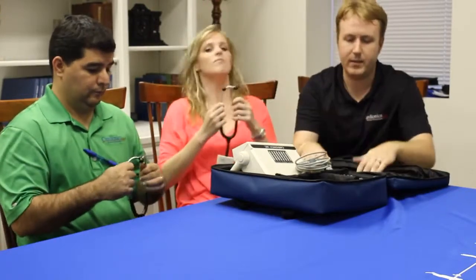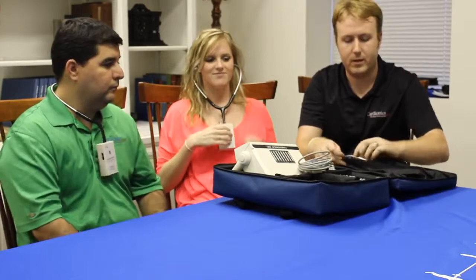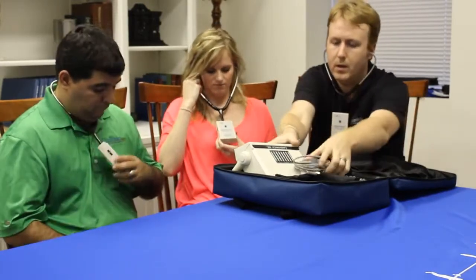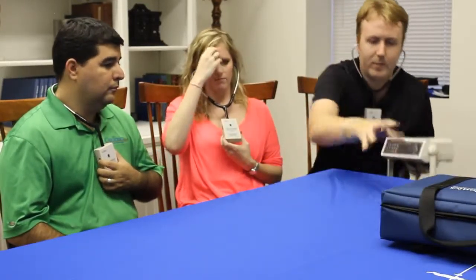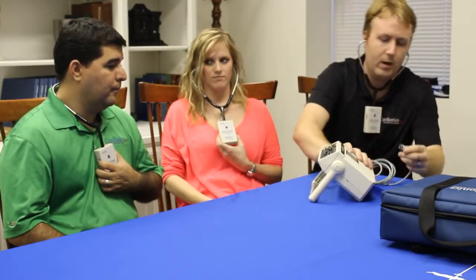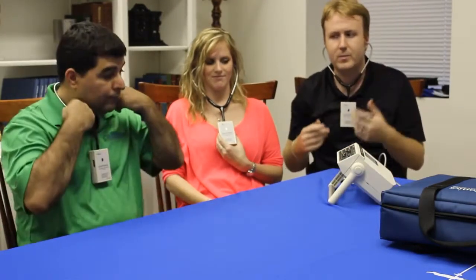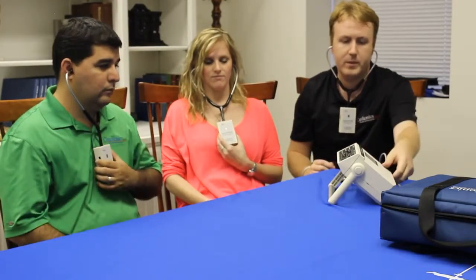So we'll all listen together simultaneously. This is essentially designed for an instructor — like myself — who would be holding the stethoscope. The package comes with six Hartman headphones, but we can add more. These headphones also interact with some of our other systems, where we can have a couple of hundred Hartman headphones within an auditorium setting.